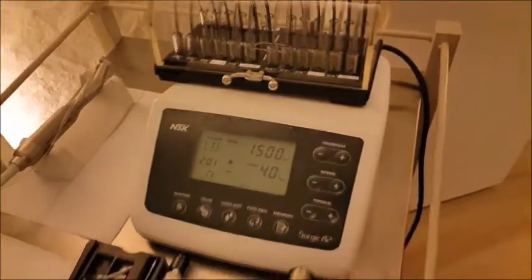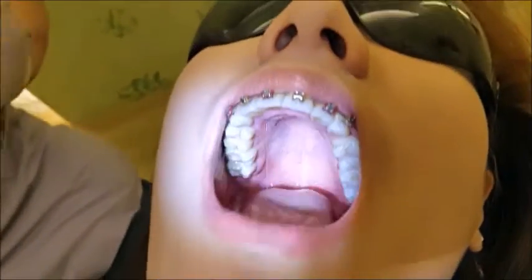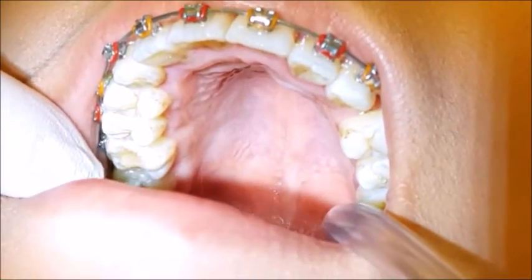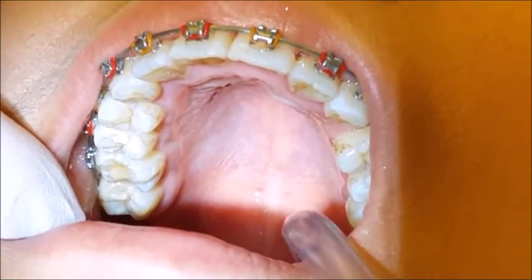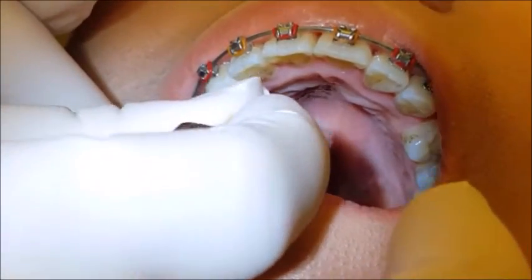We've already given a bit of topical just now, so we're going to give a bit more. Don't worry - the injection is the worst part; I'll be very gentle. I want to rub the topical in as much as we can.